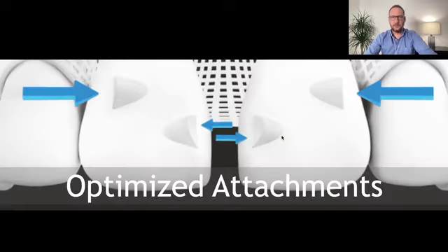Let me know later if I'm going too fast and if you want me to repeat some of these concepts, okay? With the cases, when we start looking like this for conventional attachments, it starts to become easier because you plan the final position that you want, and then you can see the tooth moving to this final position. So we can understand the direction of the movement.